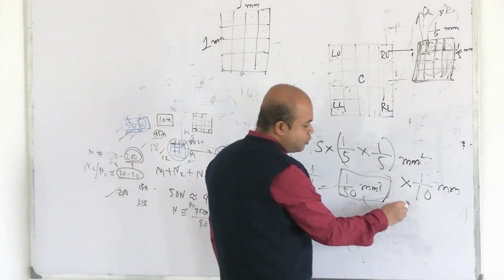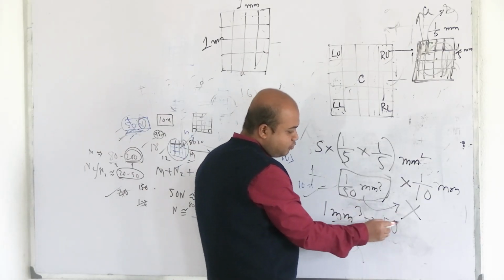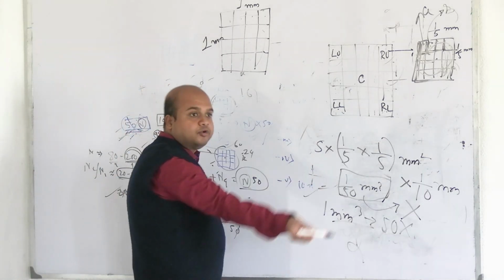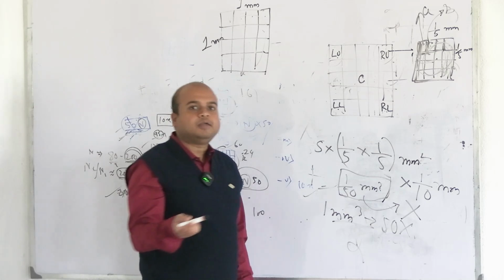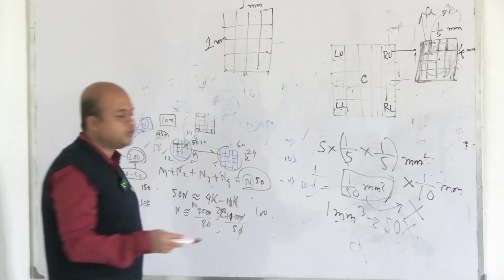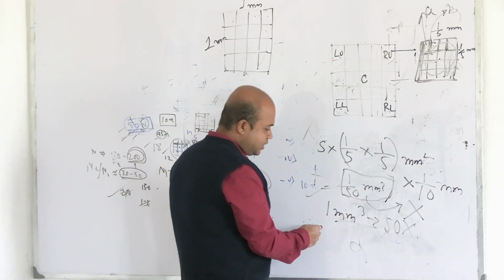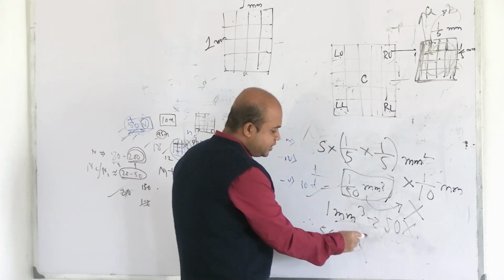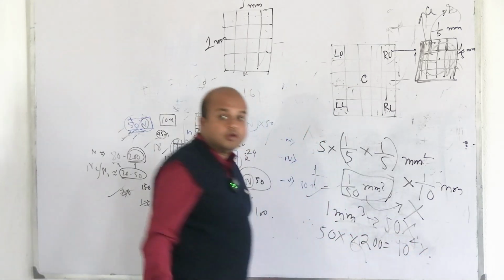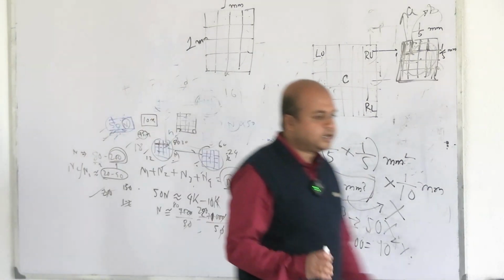1 by 50 millimeter cube contains x number of cells. So 1 millimeter cube contains x divided by 1 by 50, which is 50x number of cells, right? So 1 millimeter cube of undiluted blood will contain, here the dilution factor is 200, 101 minus 1 by 0.5. That comes from the dilution pipette, 0.5 of blood, and it has been diluted 200 times. So 50x into 200 is 10,000x, so 10 to the power 4 into x. So this is how it is calculated.